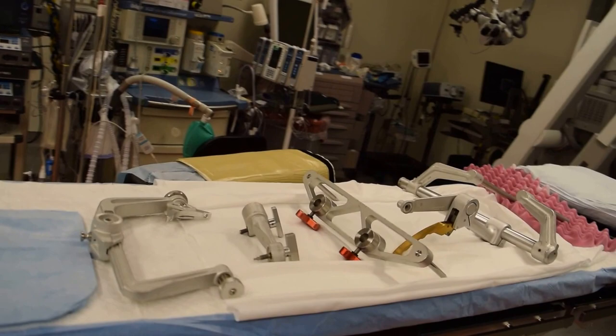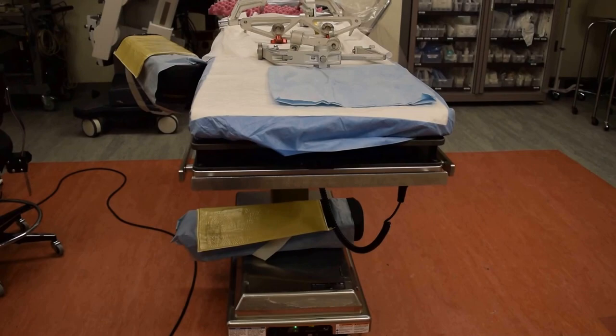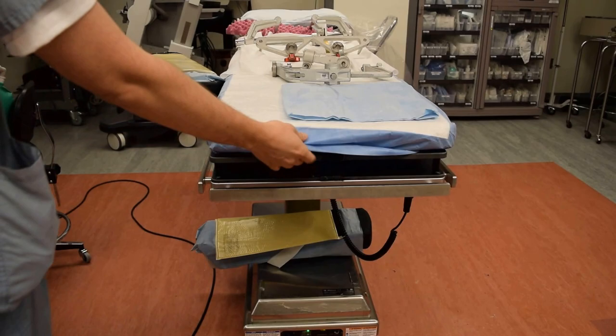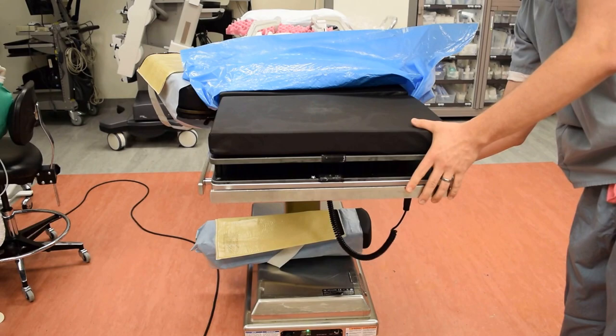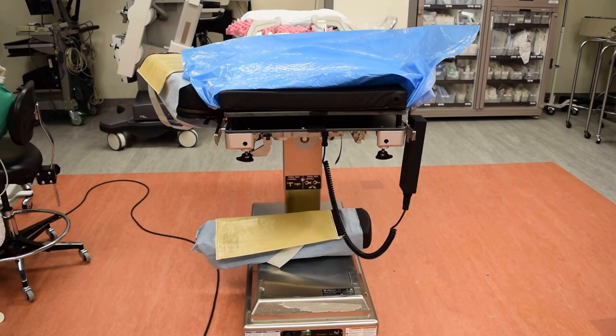Once we get the OK, one of the residents, attendings, or medical students is going to hold the patient's head still. At this point, we're going to remove the head of the bed. We're going to undo the locks on the side of the bed here and one on this side. We'd be supporting the patient's head while we remove this part of the bed.